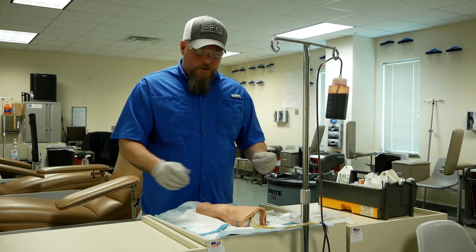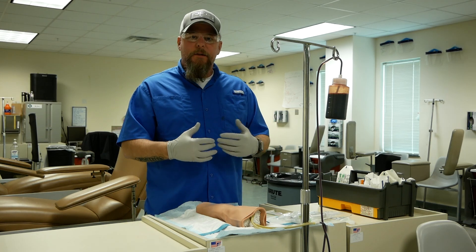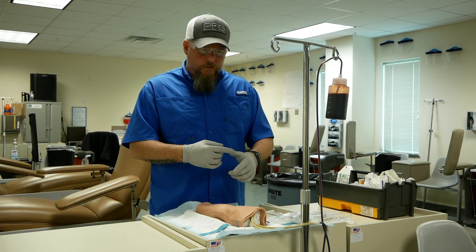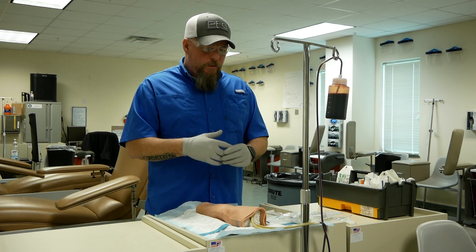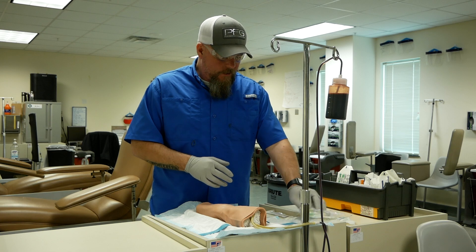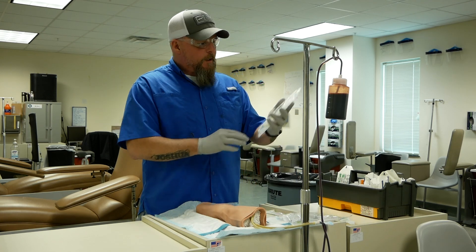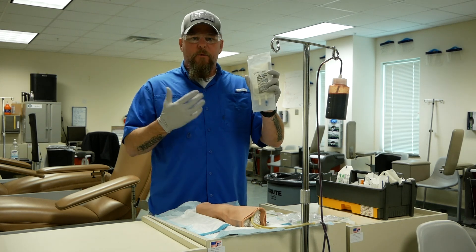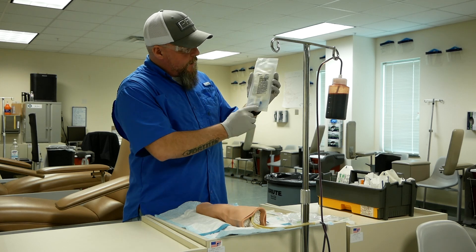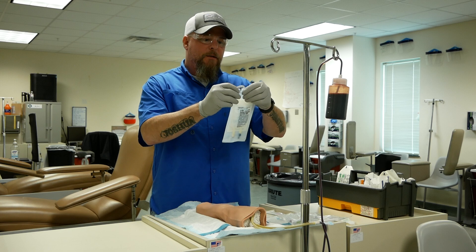We're going to start with our first check. Our first check is our six medication rights and we use the acronym triple DPRT, which stands for drug, dose, documentation, patient, route, and time. We do our first med check when we locate our medications — look down at your station, locate your medication, hold it up in the air, and say triple DPRT. Once you do your first check, inspect your outer wrapper to make sure there's not a lot of fluid. A little condensation is okay, then go ahead and open your bag.